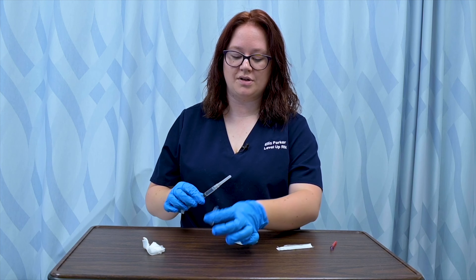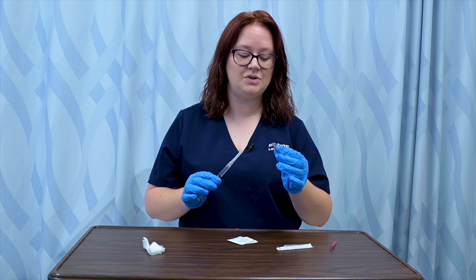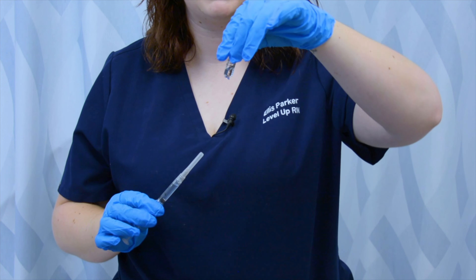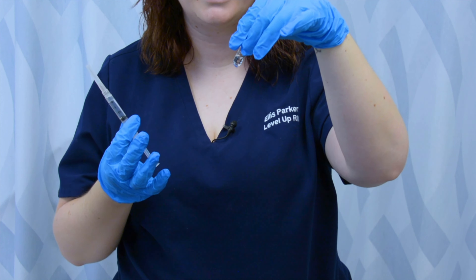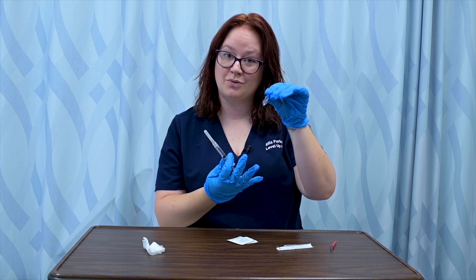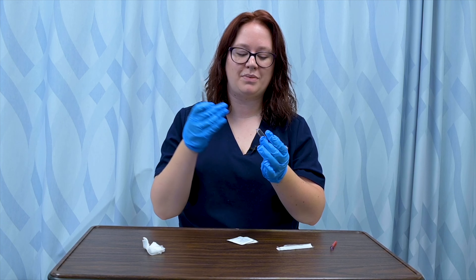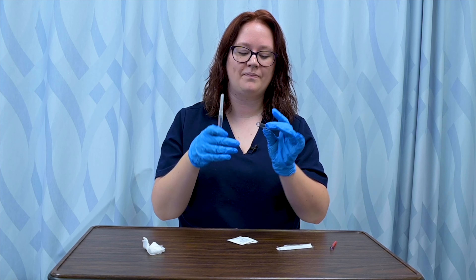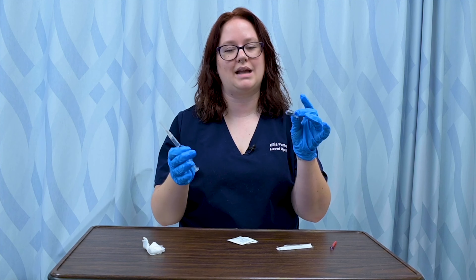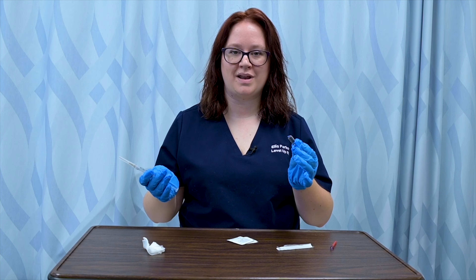A final tip about ampules: you never inject air into them. As you saw, you can hold these upside down — it's surface tension, but it feels like magic — and the liquid doesn't fall through the opening. However, if you disrupt that surface tension by inserting air into the vial, it will start leaking everywhere. So all you do is insert your needle and withdraw your medication.